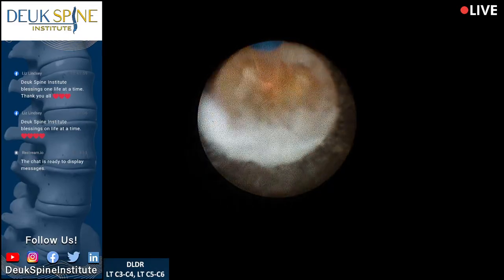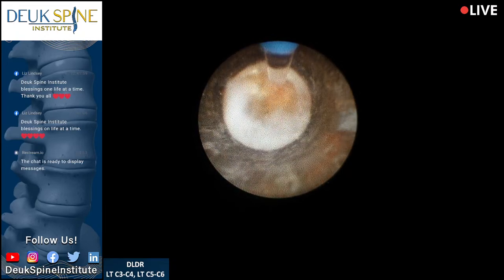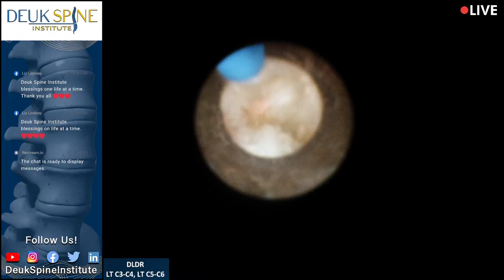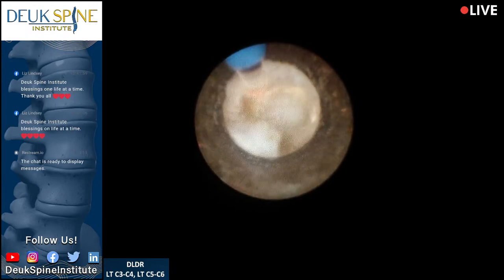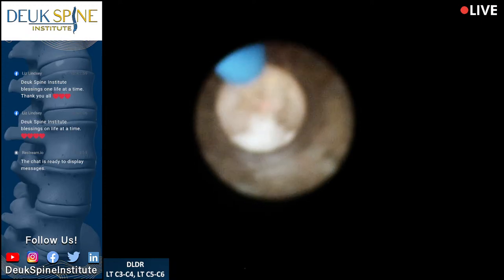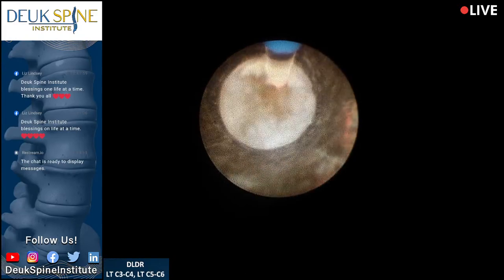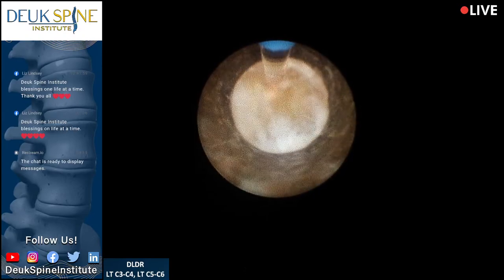What I'm seeing here is a lot of scar tissue — I'm amazed at how much. When I did the discogram a few minutes ago I was pushing dye in and we weren't seeing much because it's scarred up. The little white fluffy stuff is annulus, but below is scar tissue, and that right there is the posterior longitudinal ligament — the PLL. Here's a piece of herniation and scar tissue — you can see the golden color where the laser is working; that's calcification inside the scar tissue associated with the herniated disc.